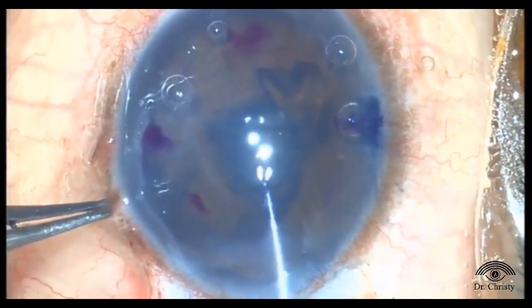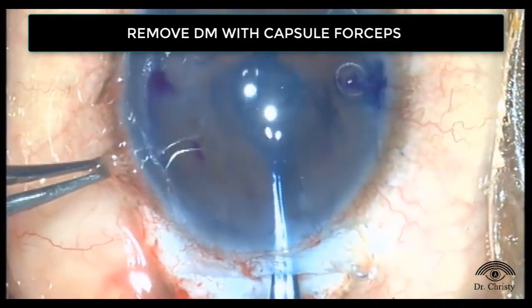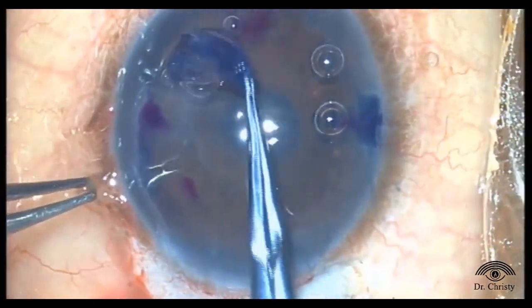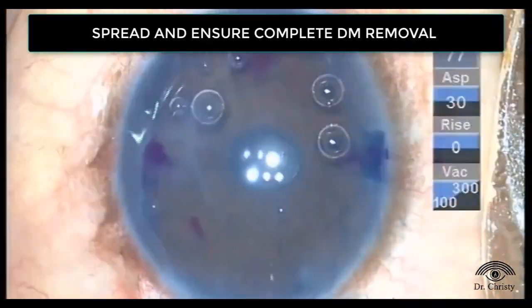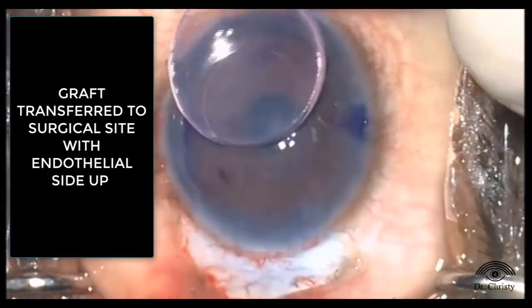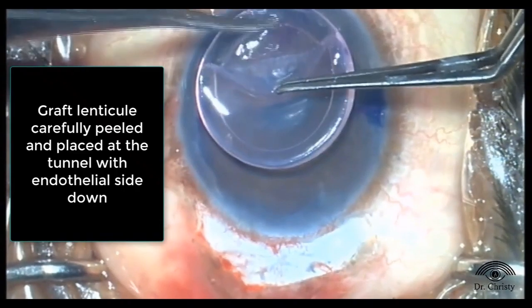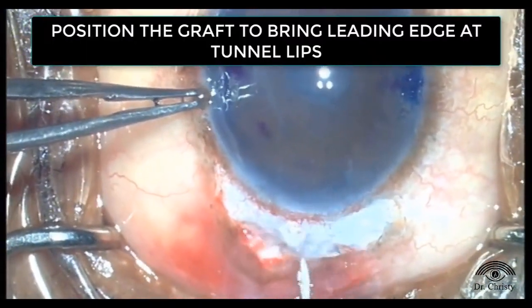Now that stained DM is pulled out carefully with the help of a blunt forceps, right? It is laid on the cornea to ensure the whole circular DM has been removed, right? And all the viscoelastic has been washed from the anterior chamber. So that's the graft. See, we are peeling off the descemet and the endothelium with some amount of stroma.